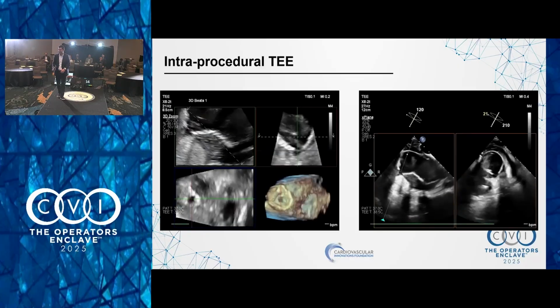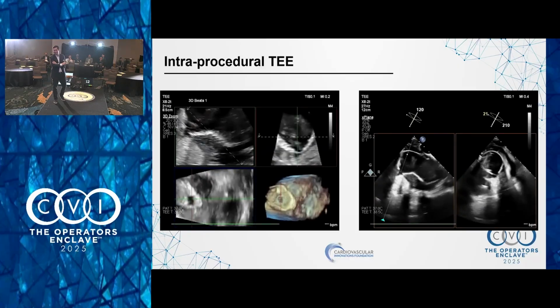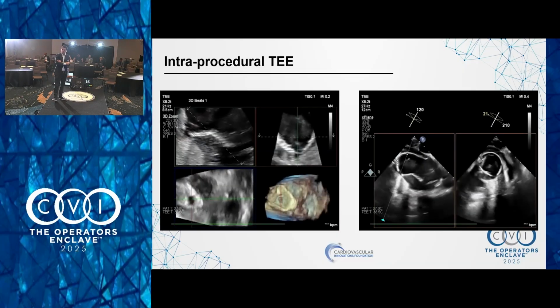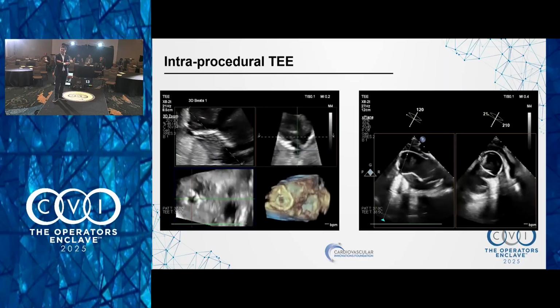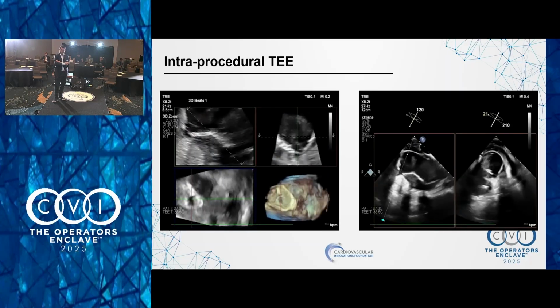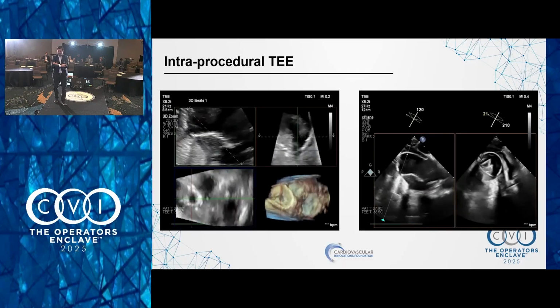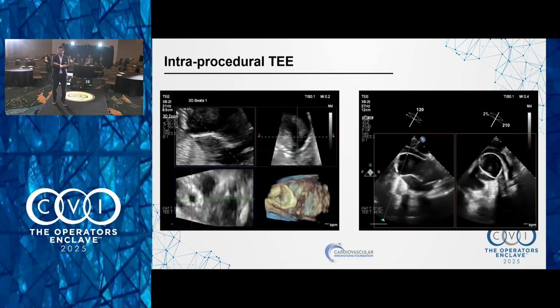So, Kashish, Ricciardi, because you've got the right coronary artery stent and the pseudoaneurysm both sharing the origin, how are you going to manage it? How are you going to close one and keep the other? Well, he has already done two guides, so I think plug with one and stent with one. Be ready with both. So you used the DK stent and plug, without the kissing, but yes.